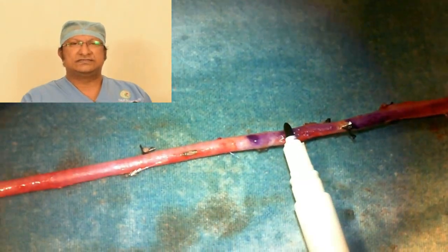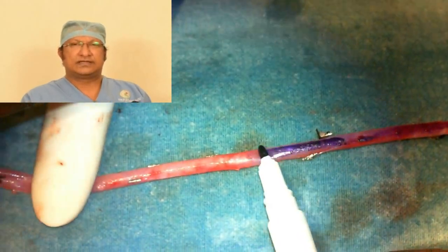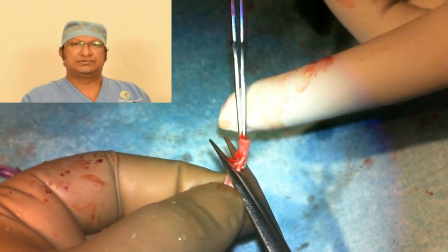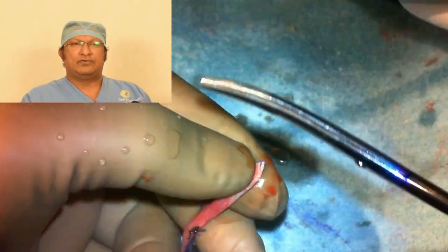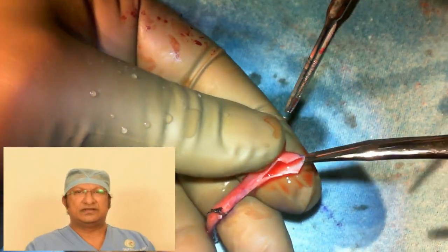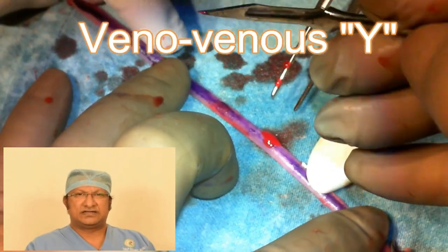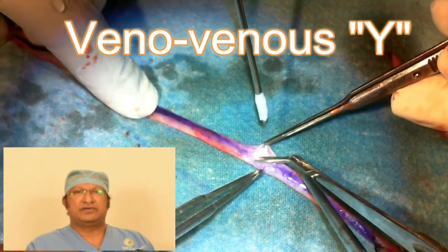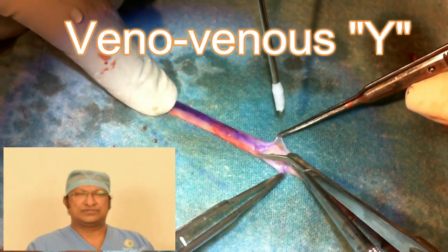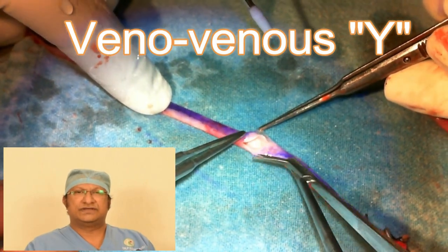This technique, which I learned from the textbook of cardiac surgery by Doty, will avoid intimal damage. If you over-distend, there is always a risk of intimal disruption. Wherever there is intimal disruption, there is platelet adherence; wherever there is platelet adherence, there are microthrombi and future occlusion. So avoid over-distension.